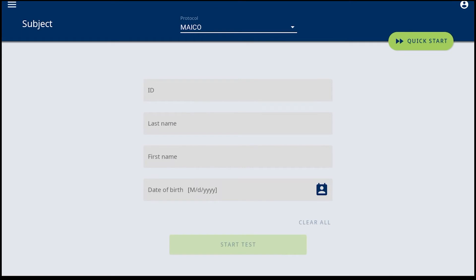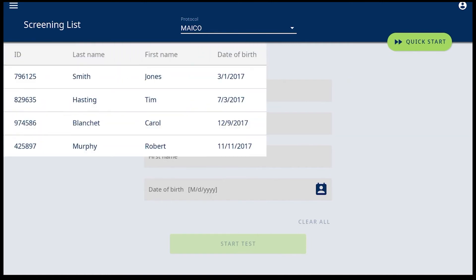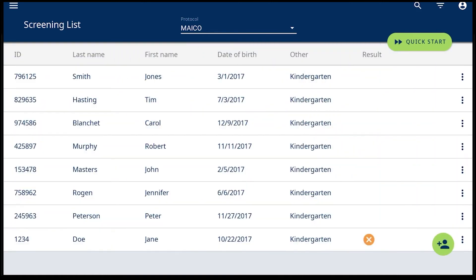For single screening mode, the results are no longer accessible through the EZtone app. When screening list mode is active, the overall result is displayed within the screening list.